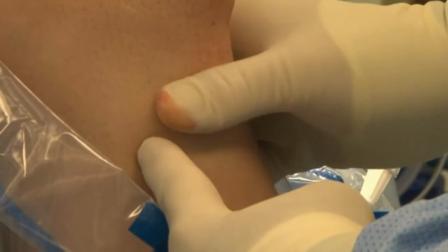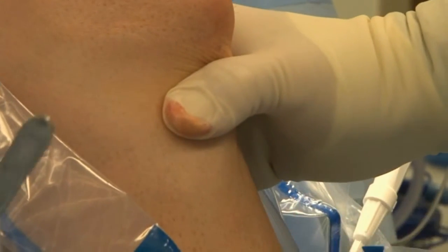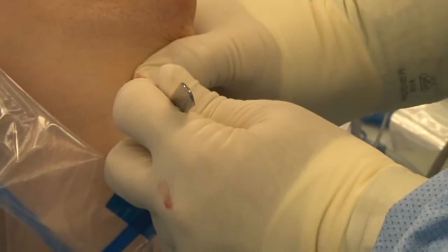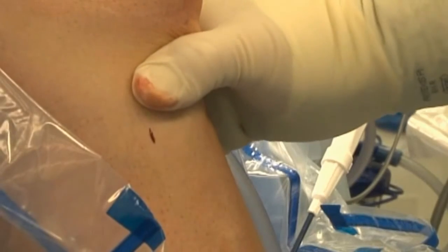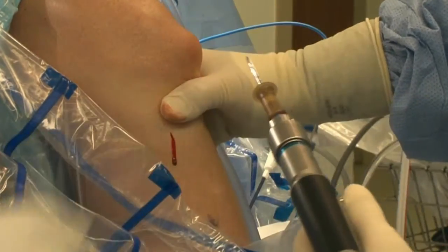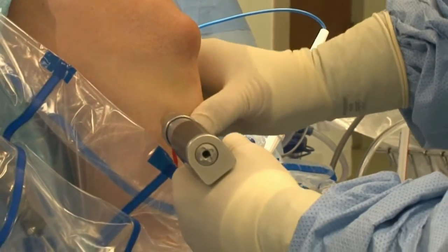Step 5. Using thumb pressure, pull the skin over the desired entry point toward the tubercle. Then, using a sterile number 11 or number 15 blade scalpel, make a small stab incision over the entry point. Step 6. Stretch the skin again to align the stab incision over the desired entry point.